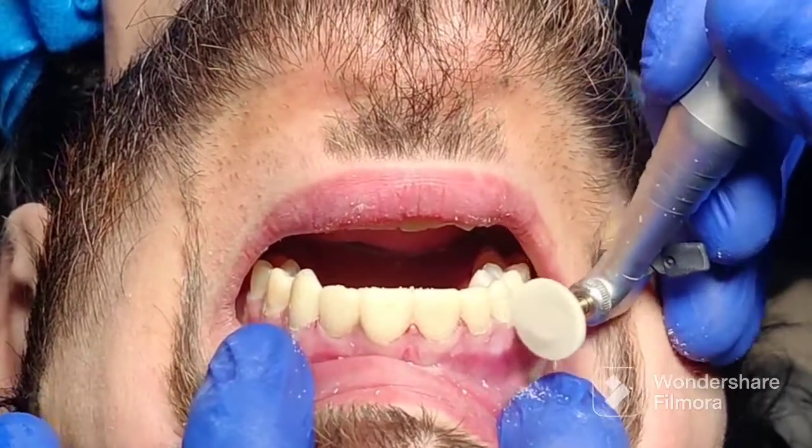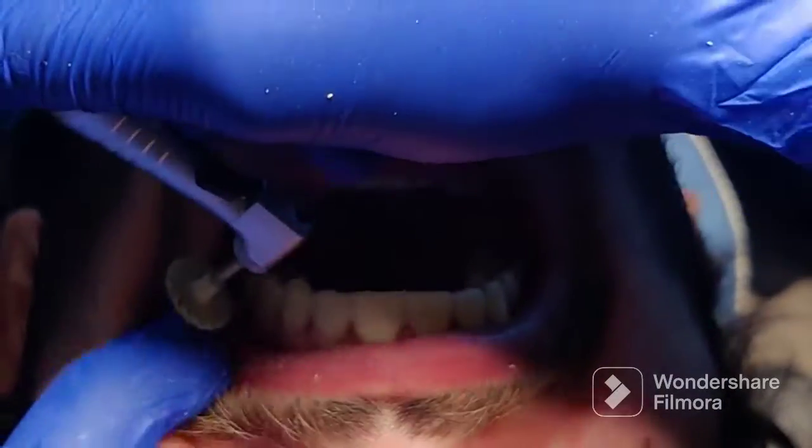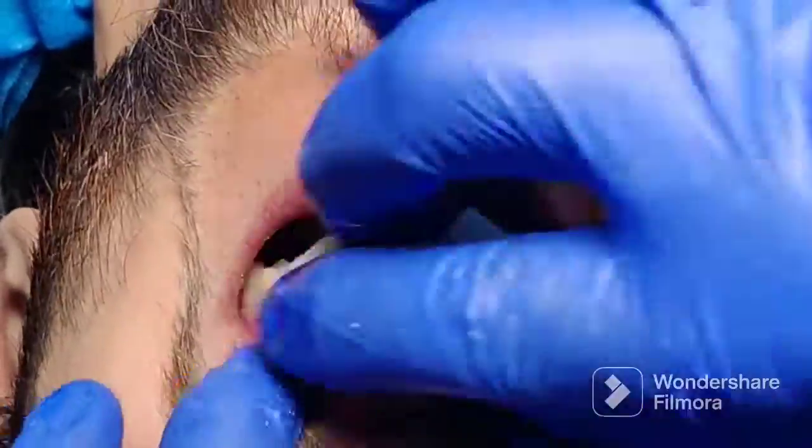Next, you want to do some finishing and polishing. Use any composite polishers that you have for your other composite restorations. Make sure you polish not only on the facial aspect but also on the lingual aspect. Then adjust the bite and you are done.